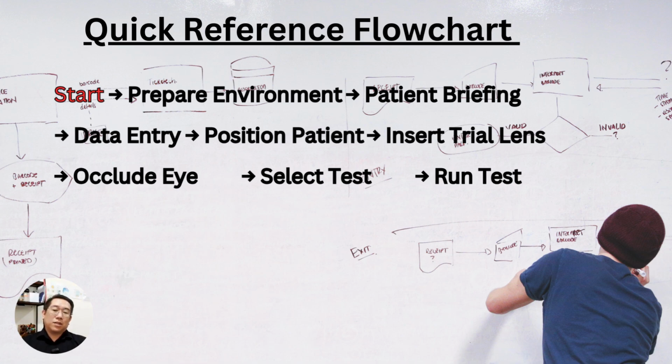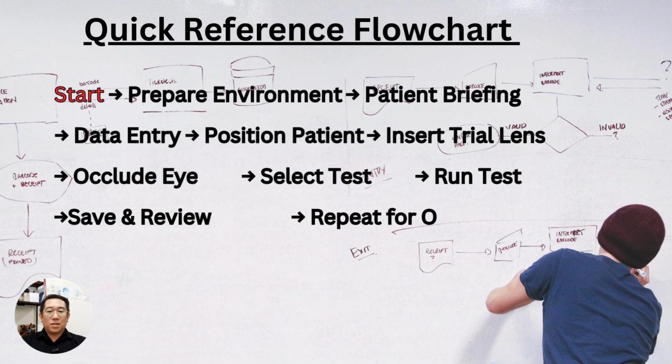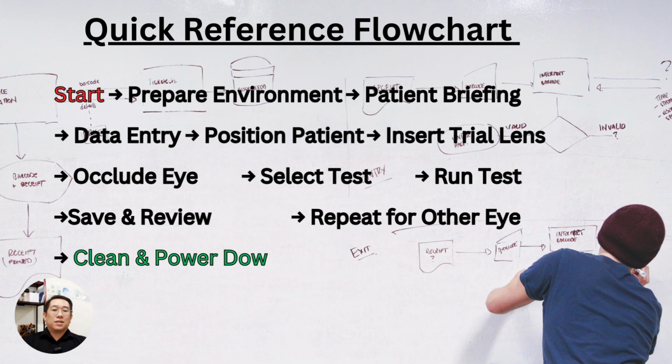Run the test while monitoring patient's cooperation. Then after the test sequence ends, save and review the result. Repeat the same process for the other eye if required. Lastly, clean and power down the device, covering it with the dust cover for protection.